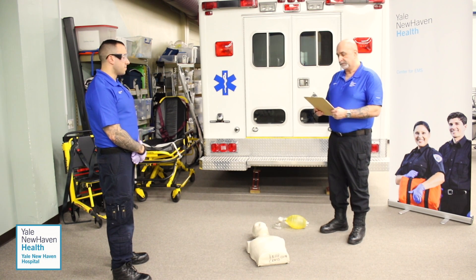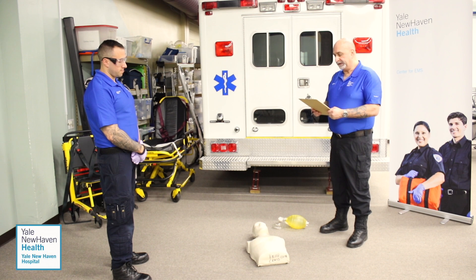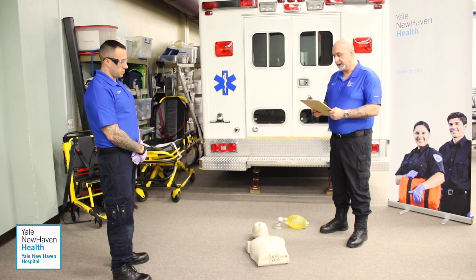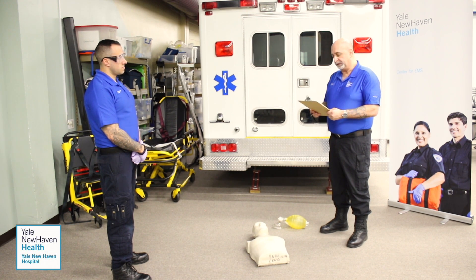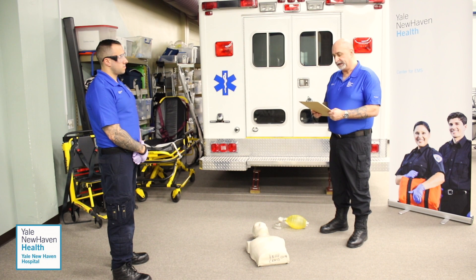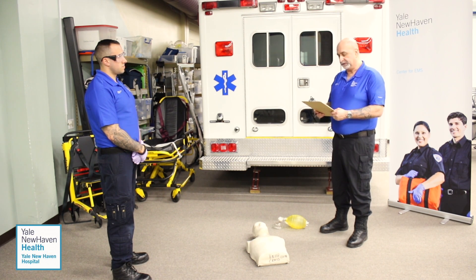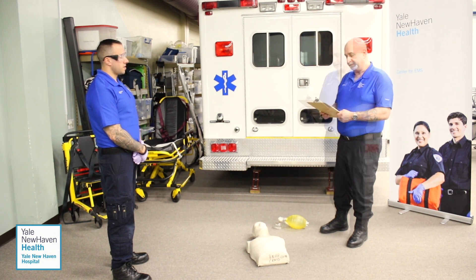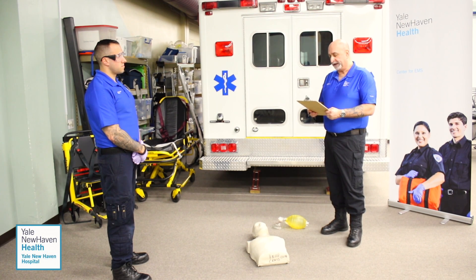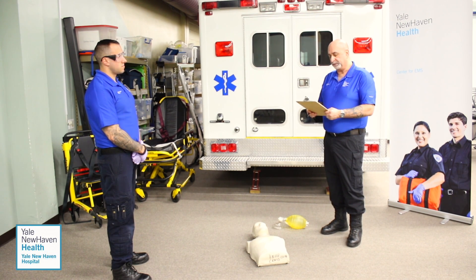I'm ready. You will have ten minutes to complete the skill once we begin. I may ask questions for clarification and will acknowledge the treatment you indicate as necessary. Do you have any questions? I do not. You respond to a call and find the patient lying on the floor. There are no bystanders present.